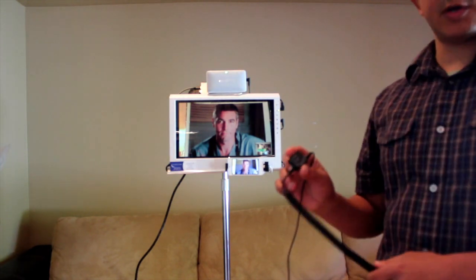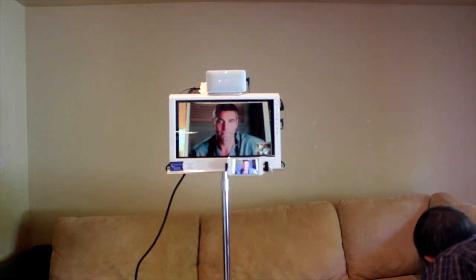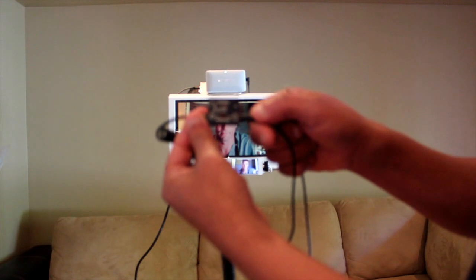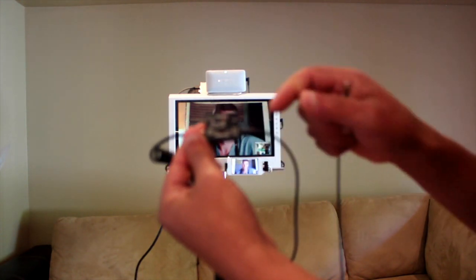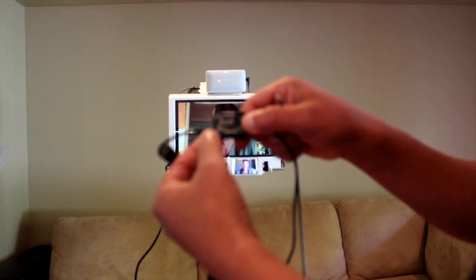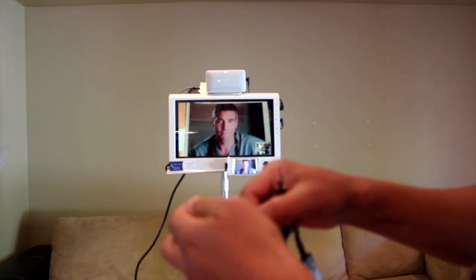The first feature I would like to go over is this little box right here. This little box is very important and needs to be set up just so that you can do the auscultation properly. You'll notice on this little box we have an icon that represents the stethoscope, and the wire coming out next to that little box should go directly to the stethoscope itself, like so.